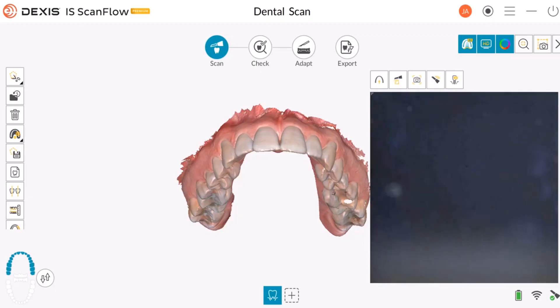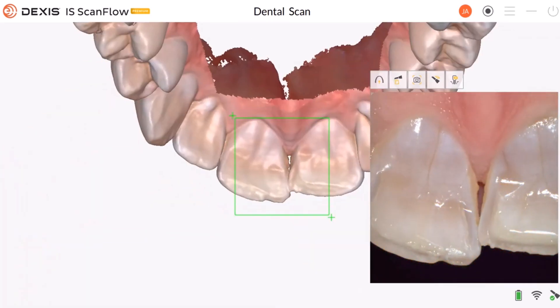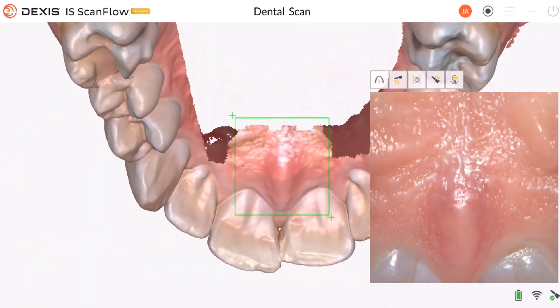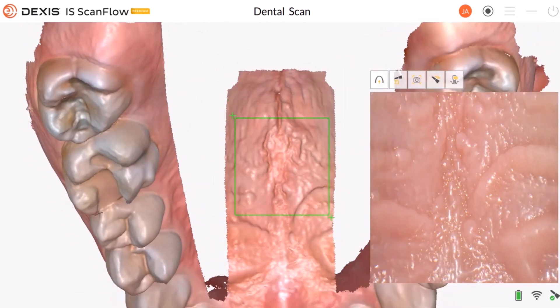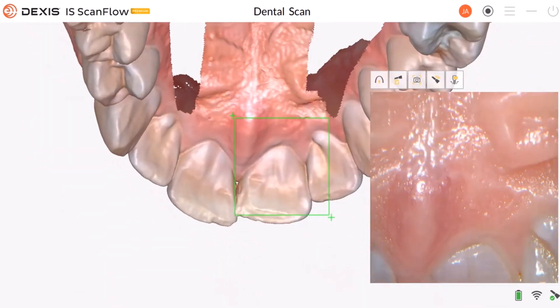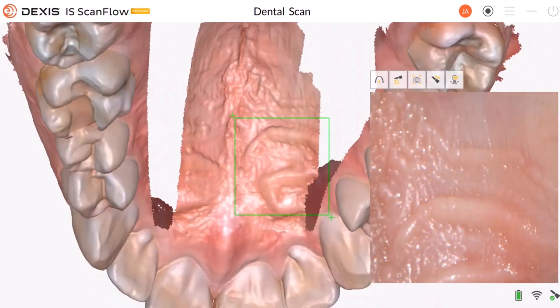A good place to start scanning the palette is to start behind tooth number 8 and 9. Slowly go back to whatever depth is needed for the palette, move a little bit to one side, then bring it back out. Move it like a zigzag or a W motion.